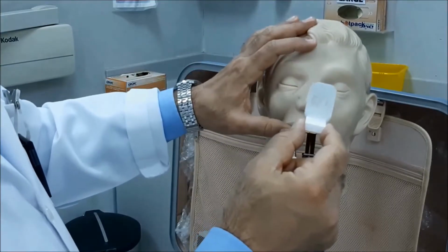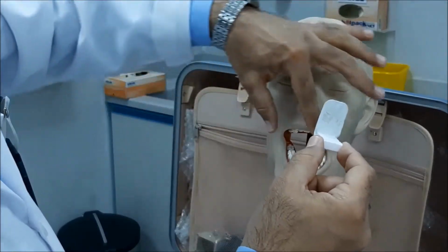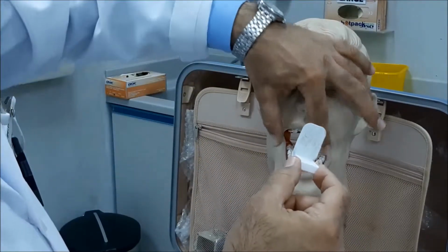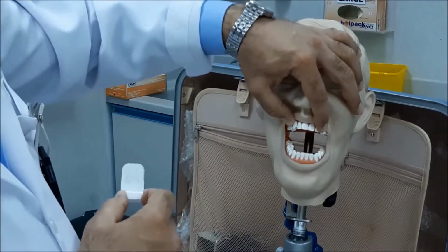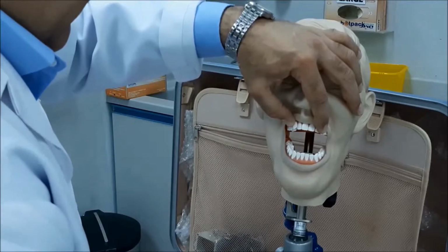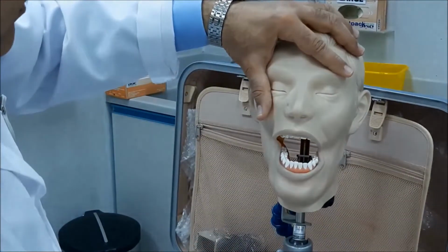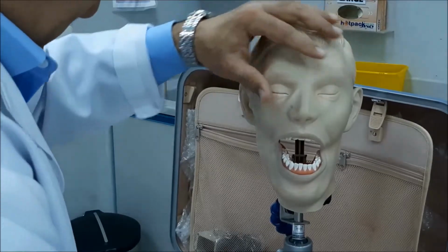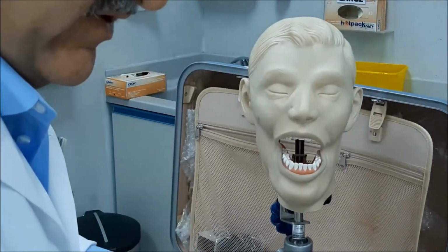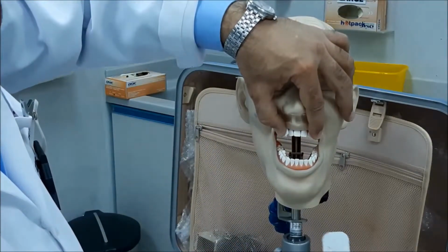You want the upper incisors or the upper segment or the lower segment, it is the same. You ask the patient to open wide. You reflect the lip so that you see the tooth that you want to radiograph, and then again you will have a look inside the patient's mouth just to get acquainted with the anatomy of the area, if there is anything or any interferences. So let's take the central incisors, for instance.